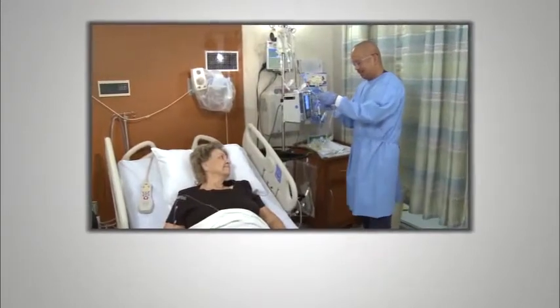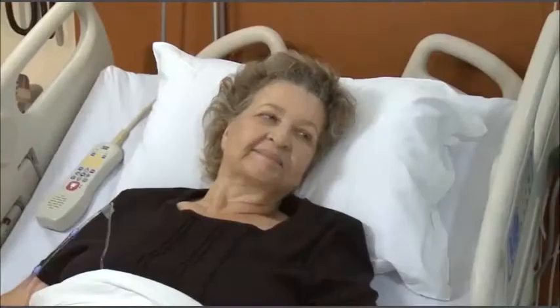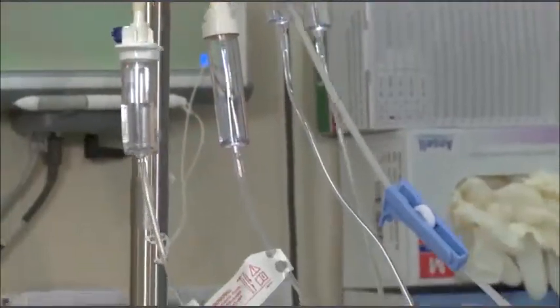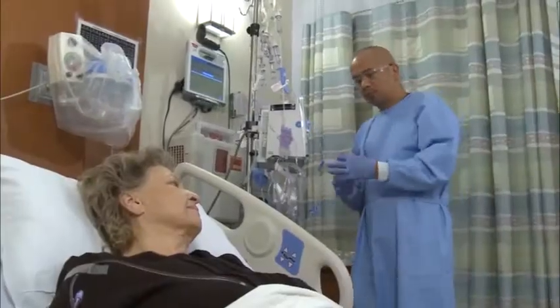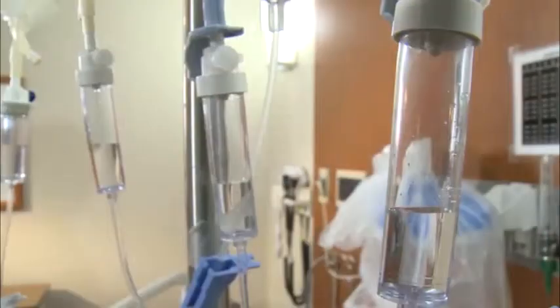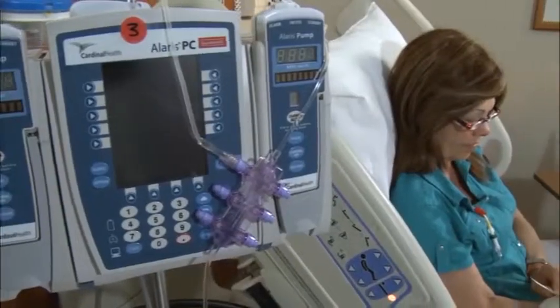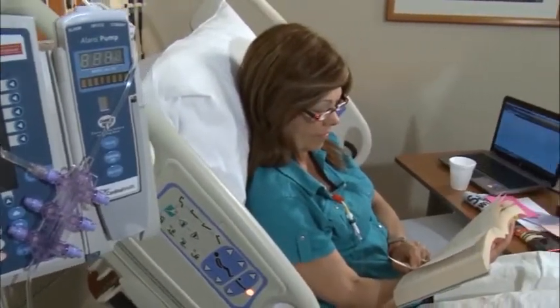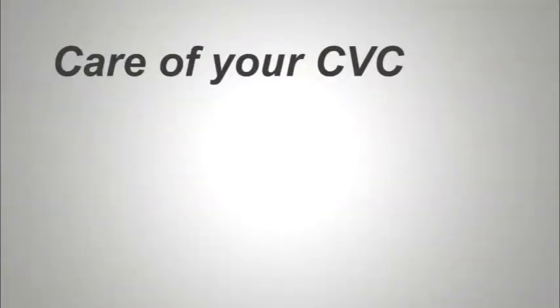The advantage of having a CVC is that it can be used repeatedly. You won't need a new IV inserted every time you have a treatment. Also, many chemotherapy medicines must be given through a CVC. There may still be some times when you need a small, temporary IV in your arm, but the CVC meets most IV needs. There are three parts to the care of your CVC.